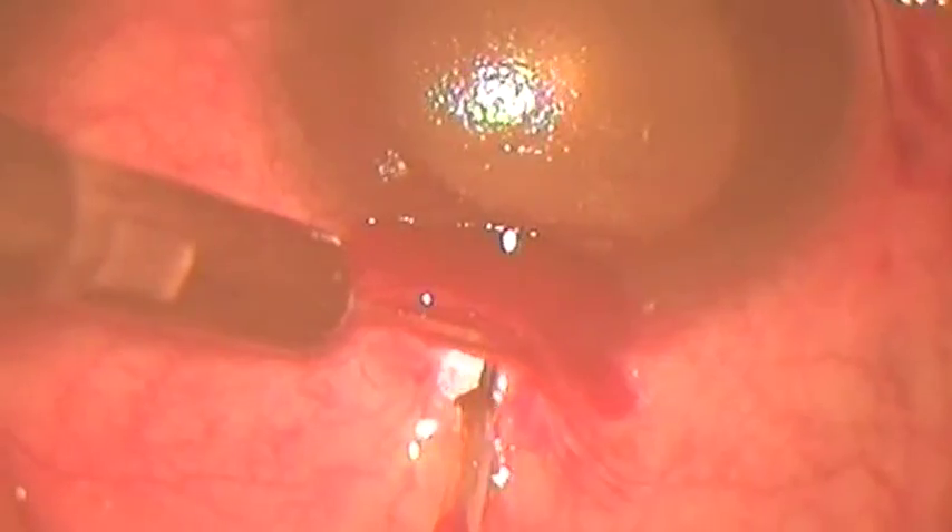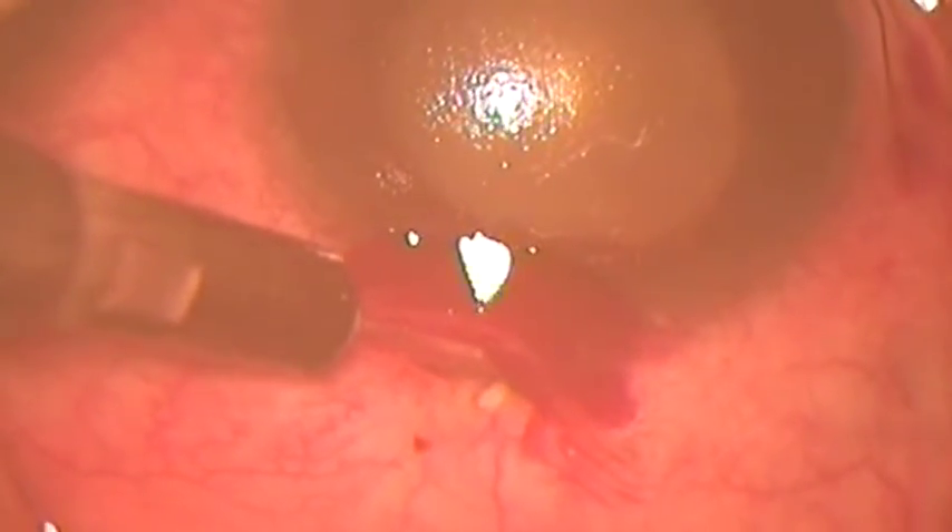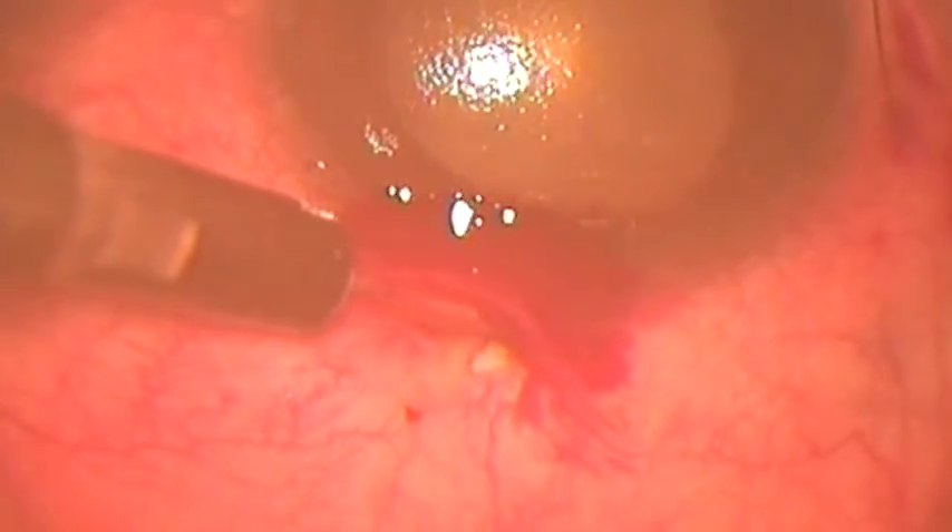A half-thickness incision has been made in the cornea. The conjunctiva is pushed to the limbus, and we succeed in making one track with a 200-micron fugoblade tip.